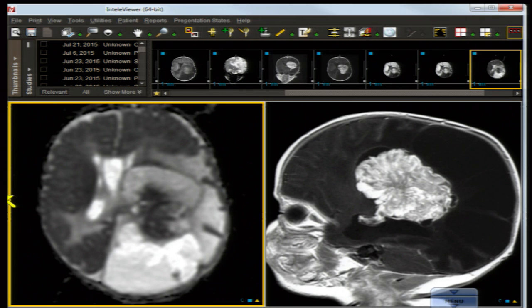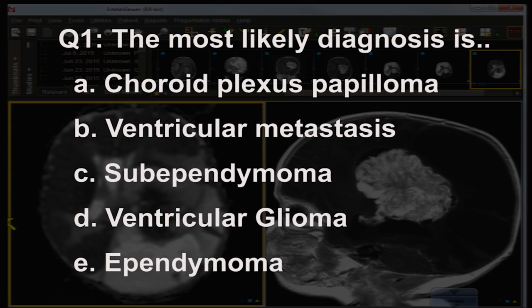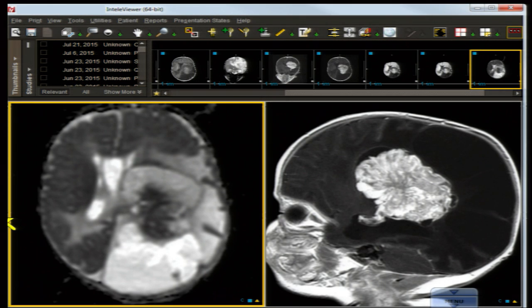The answer to question one is choroid plexus papilloma. Could it have been a carcinoma? Certainly — sometimes only histology will tell — but choroid plexus carcinoma was not a choice. This is an infant with a large papillary mass in the left lateral ventricle atrial trigone; you should reflexively choose choroid plexus papilloma. Ventricular metastases in somebody under age two — metastatic disease to the ventricular system — if you chose this, you're probably not being very practical.